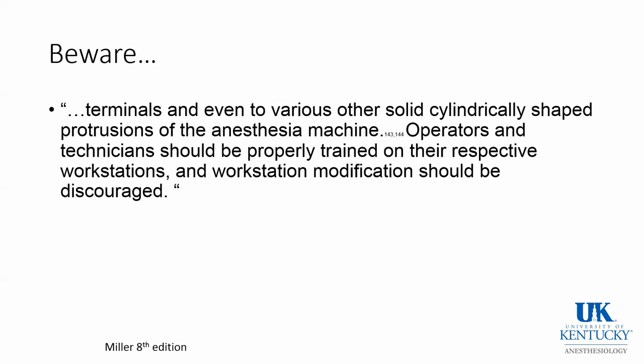I don't know if this means that we should not use double length extensions on our adjustable length circuits or not. The anesthesia workstation engineers have likely designed the breathing circuit to function with tubing of a certain length and compliance. Automated checkout and compliance compensation may be performed by the machine, but not if the circuit is modified after the checkout has been performed.